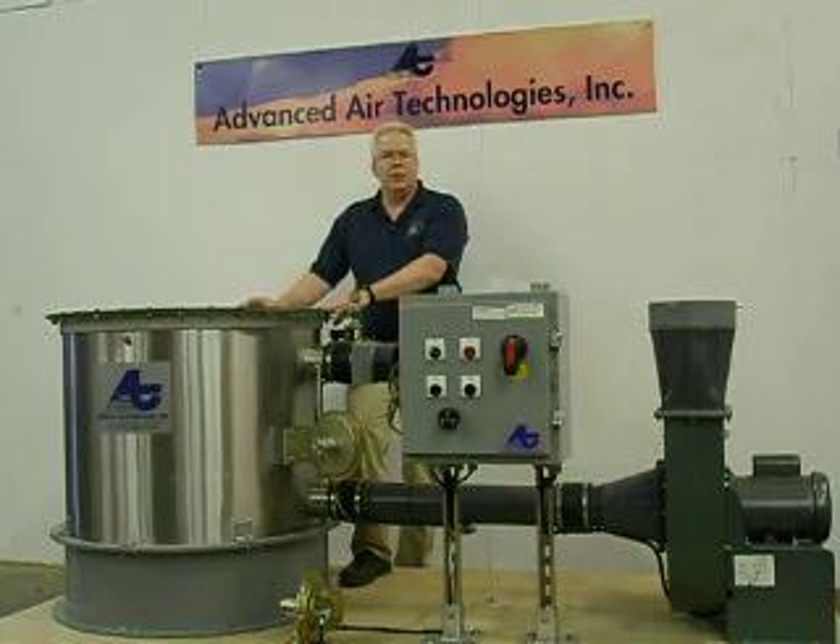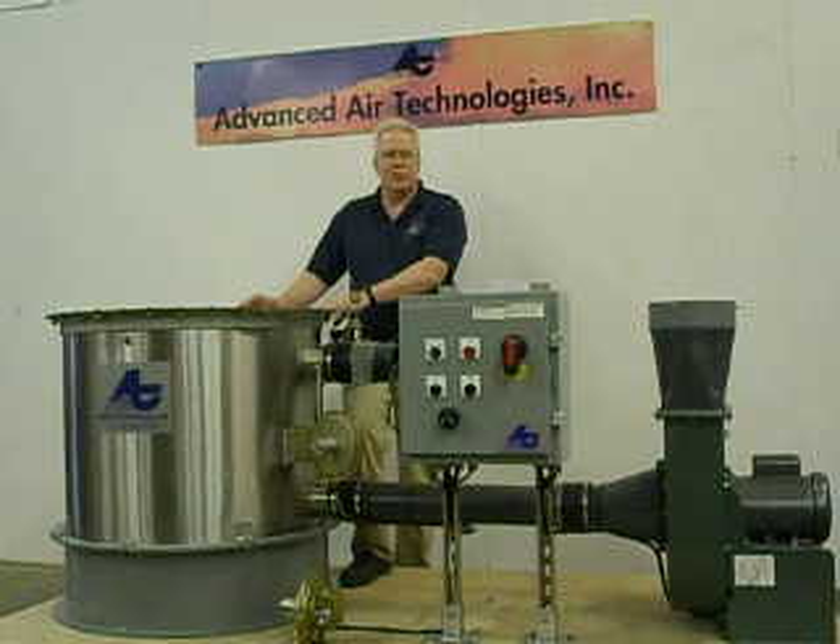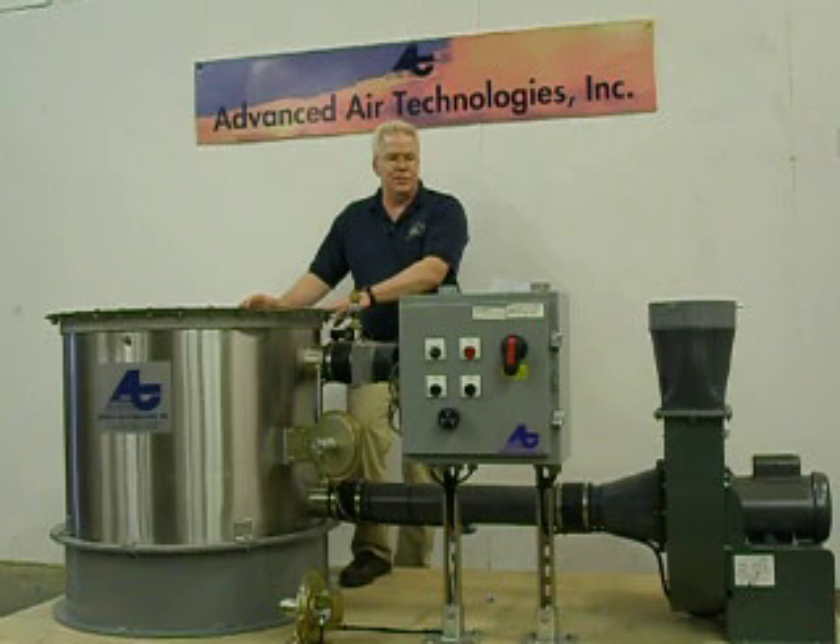All these components can be rearranged for the best use of space at our customer's hospital facility. Removal efficiency of this system is 99.6% or better for ethylene oxide.